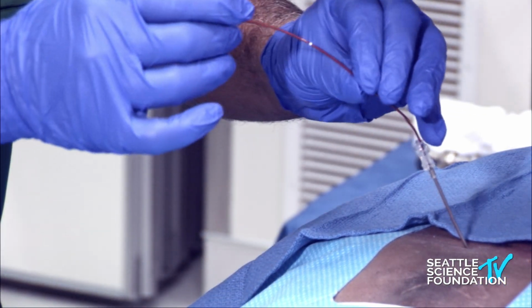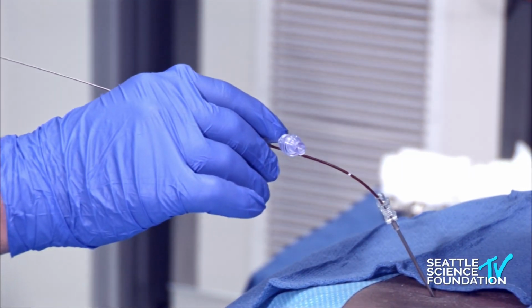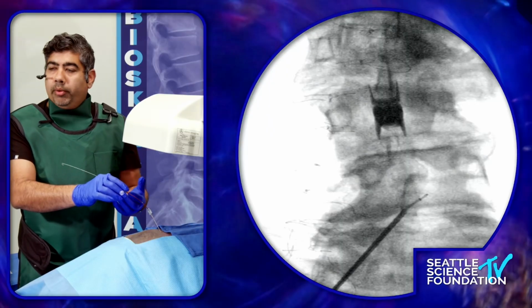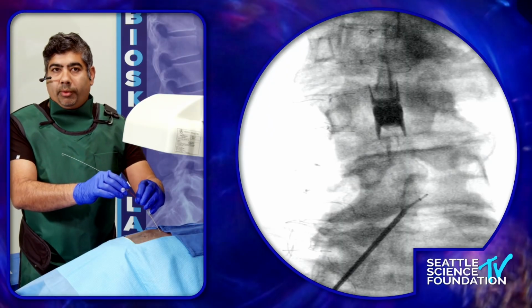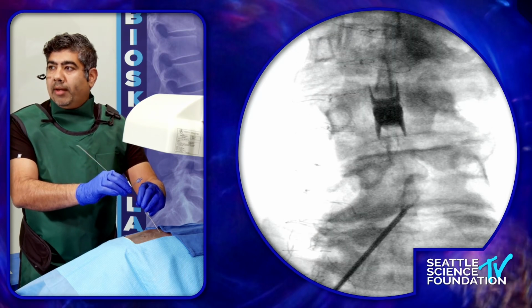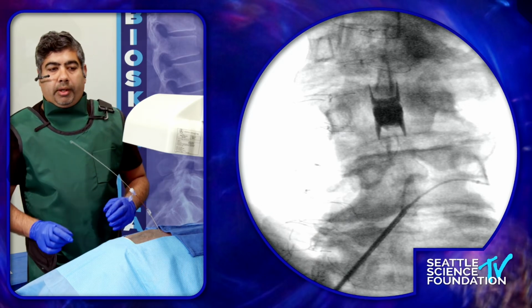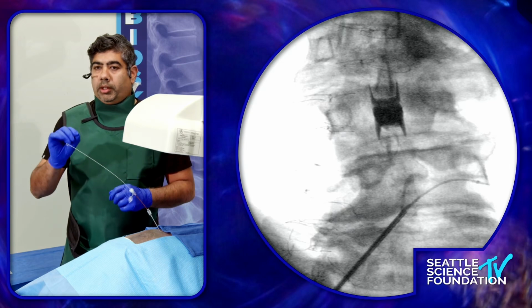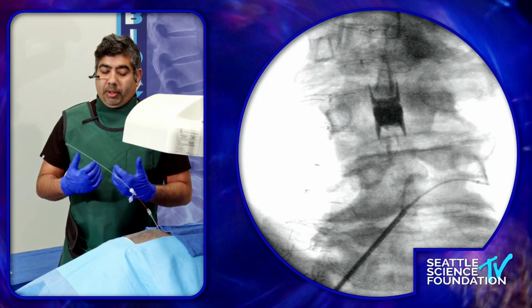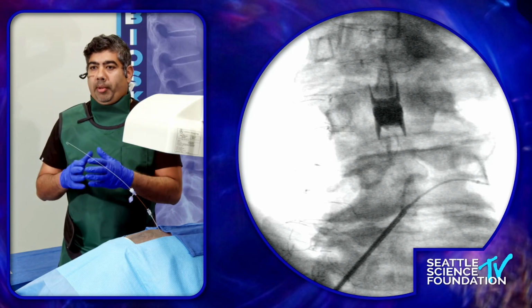If you look at this sheath, or the driver as I will refer to it, there are two white marks on it. As soon as the first white mark gets in, you know that you're out into the epidural space. So I'm going to take an X-ray here, and all I'm doing is following that trajectory towards that right-sided L4 dorsal root ganglion. Sometimes you may have to do a quick short run of live fluoroscopy. As soon as you enter, I don't know if you guys saw that, there was a gentle pop which you noticed on that X-ray, and something which I felt, which tells me that I'm now through the intraforaminal ligaments.